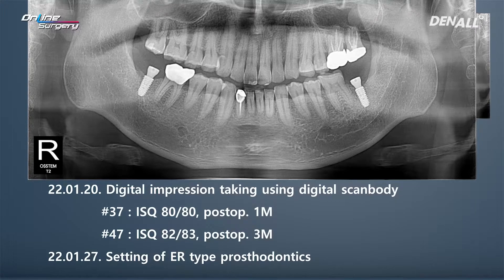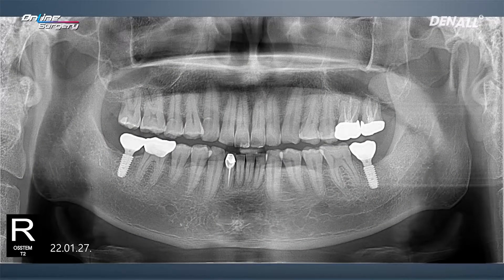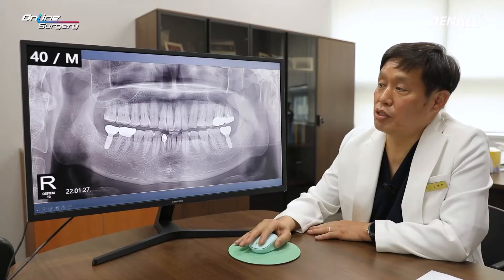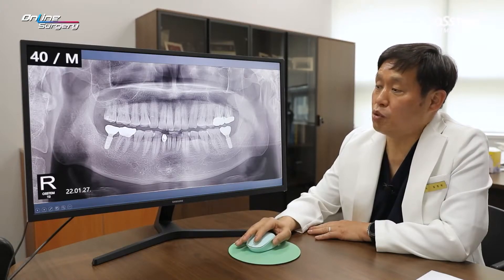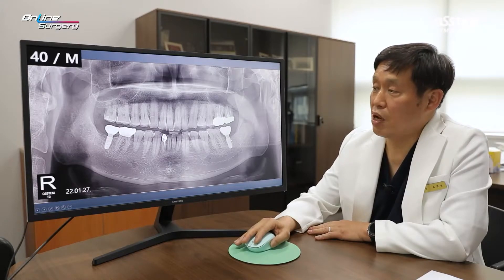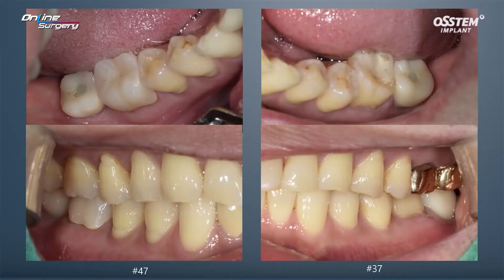After one week, an ER type prosthesis was provided. For number 37, one month after surgery, a scan body was used to take a digital impression and the prosthesis was delivered. For number 47, the prosthesis was delivered three months after surgery. Even though number 37 was an extraction socket, using the SOI surface allowed favorable ISQ measurement after one month, and the prosthesis was delivered. Number 47 and 37 ER type prostheses were delivered and this is the result in occlusion.